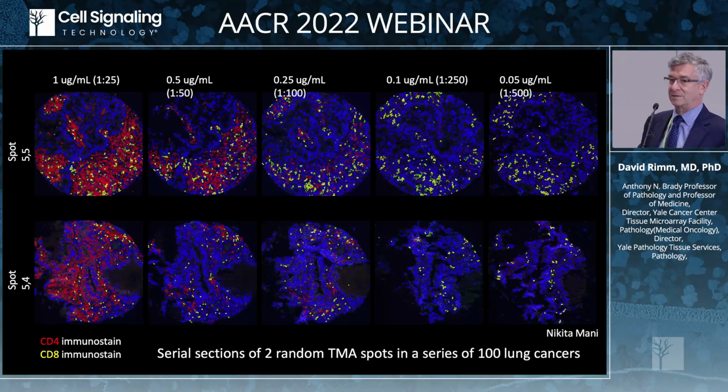But I think that this is one of the huge pitfalls of segmentation, that you don't know if you're right or not. And various different people in different labs can get different results by having different concentrations of the antibody, or even thinking they're using the same concentration of the antibody, but one is 6 months old, that's been sitting in the refrigerator for all that time, and it's lost some of its reactivity. And so this is a big word of warning for segmenters who count lymphocytes.